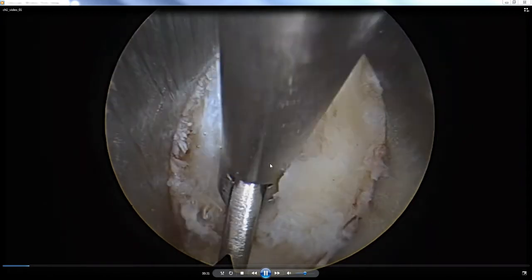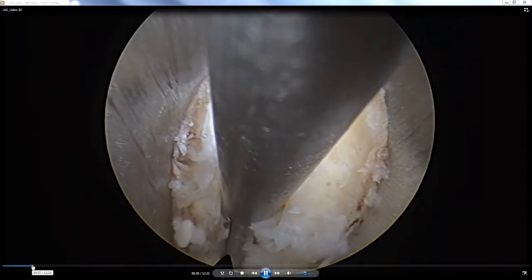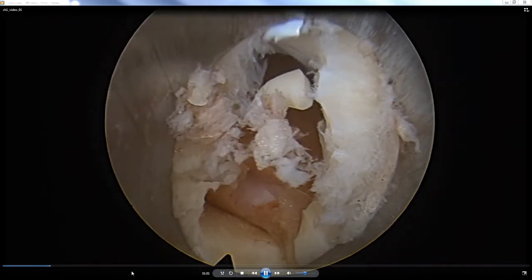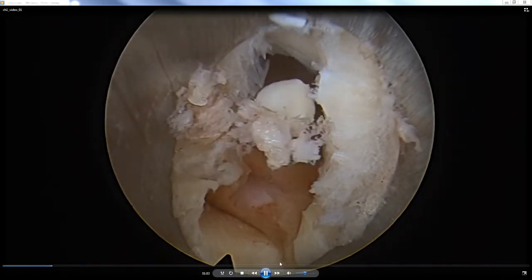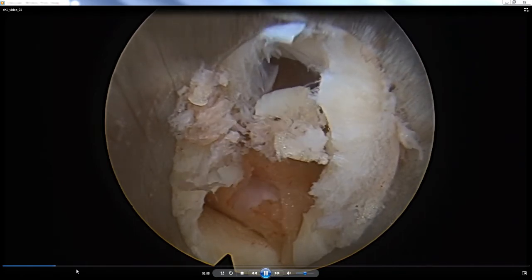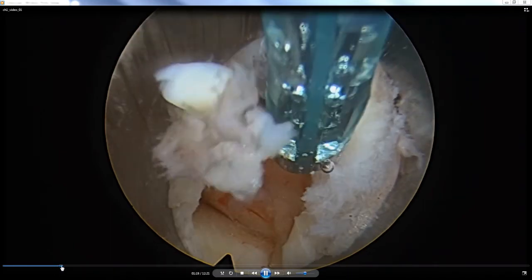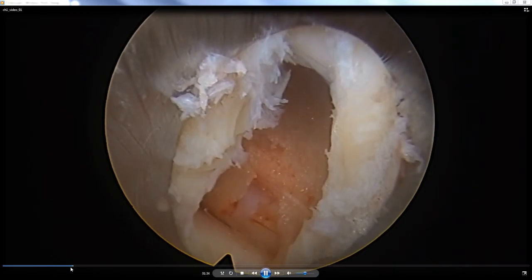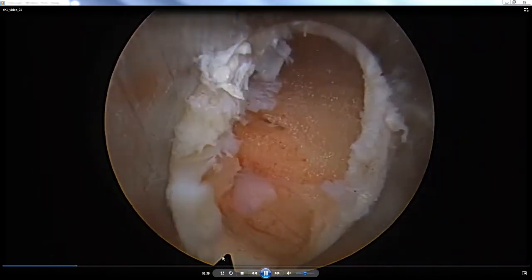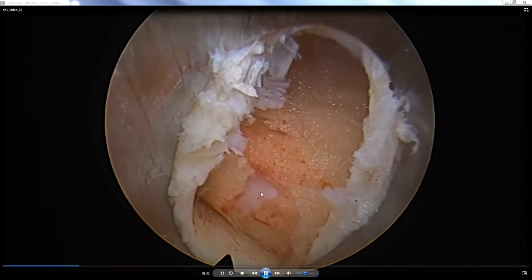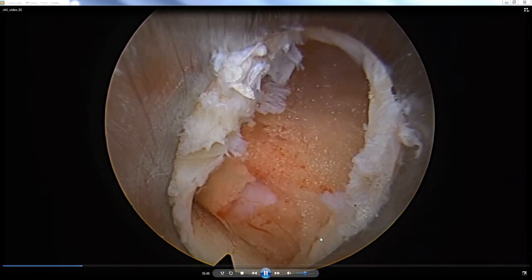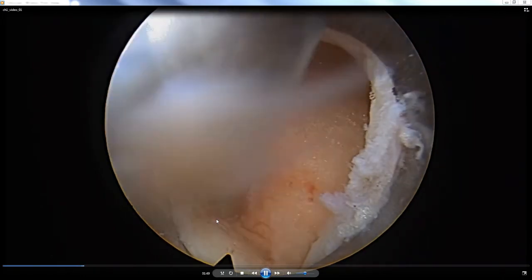There you can see pulsatile epidural fat inside the spinal canal. After making my opening into the ligamentum flavum and tidying up the edges, I've advanced the cannula just a tiny bit. You can see the S1 nerve root coming into view just inside the lateral recess. As we advance further and clean up the edges with a bipolar cautery device, we expose the S1 nerve root — that white tubular structure running from about 11 o'clock down to 5 o'clock — and the lateral recess just down on the side.